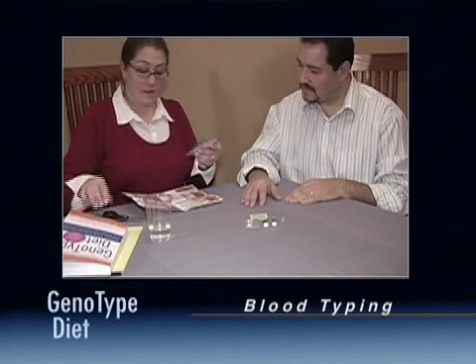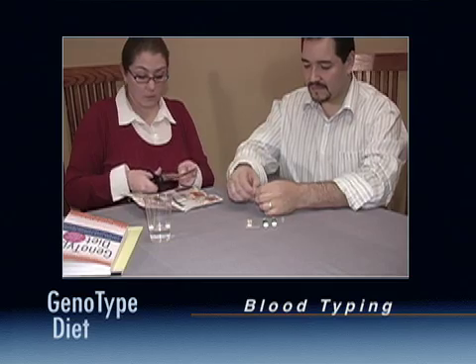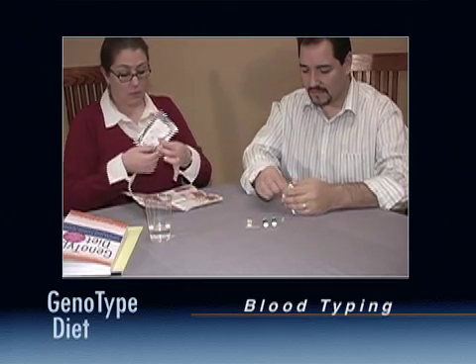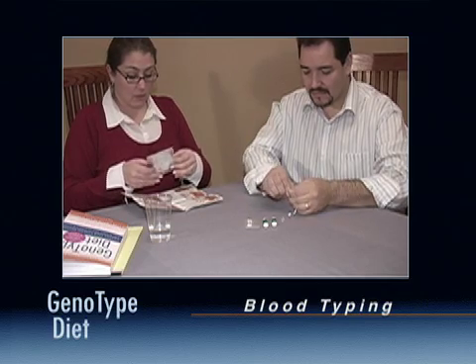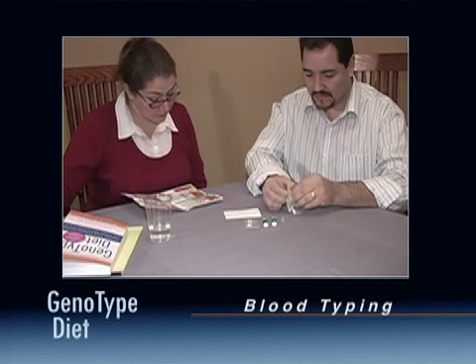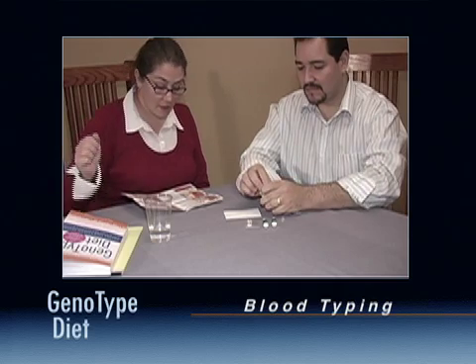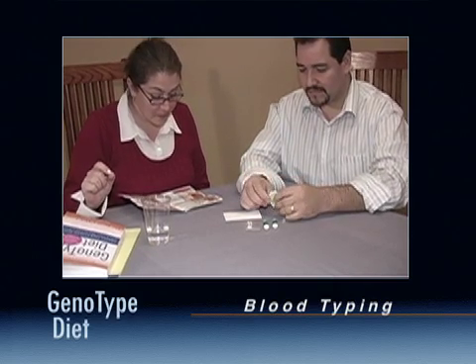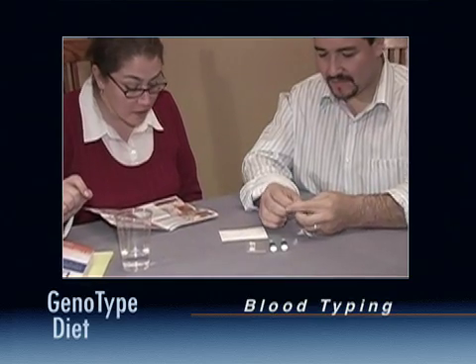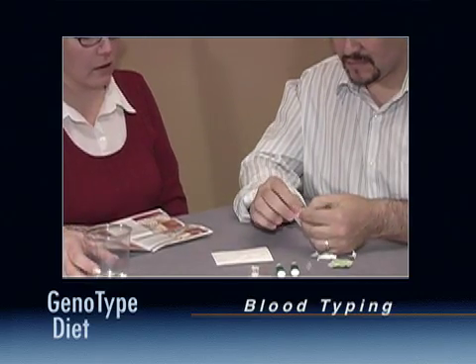Open the home test kit and remove the card from its foil wrapper. Be careful not to touch the four rings at the top of the card. You may want to write your name on the card. Wash and dry your hands, then disinfect the fingertip with the alcohol wipe included with the kit and let dry.